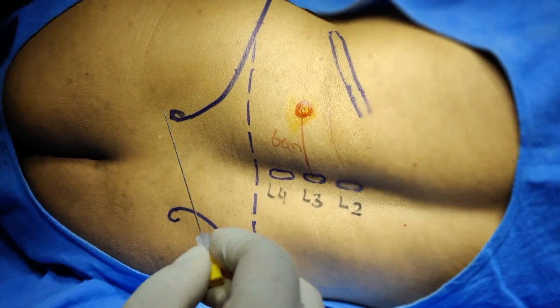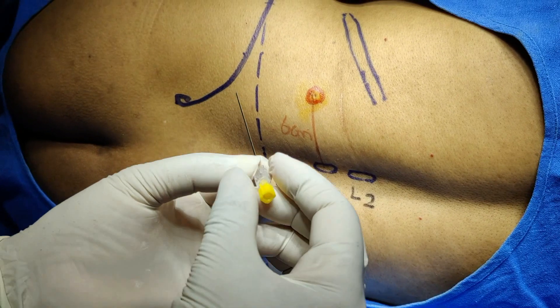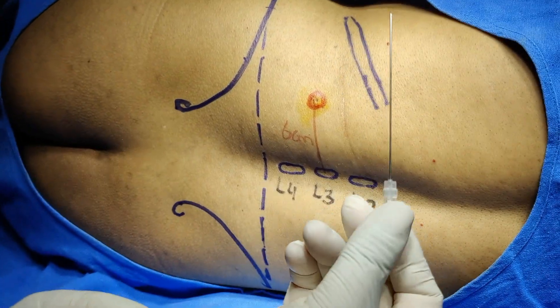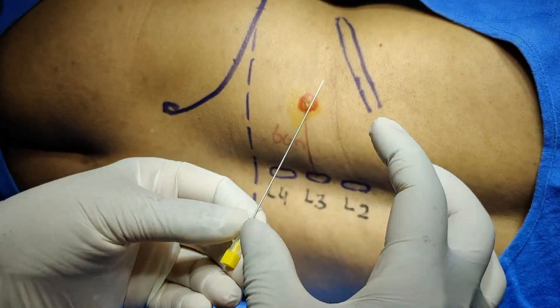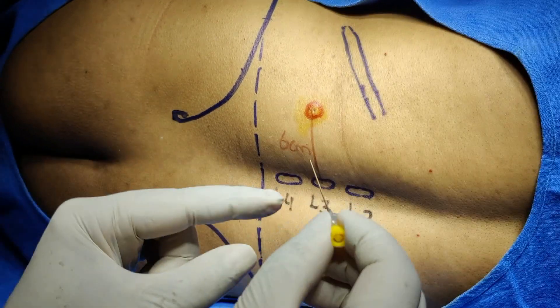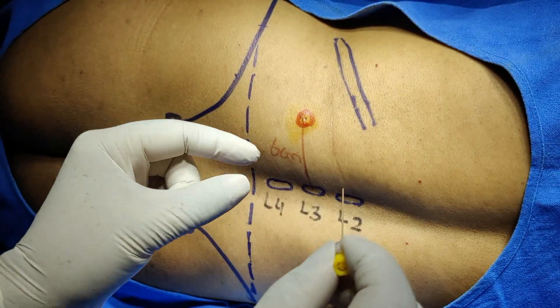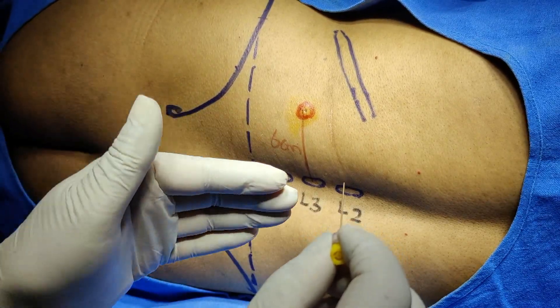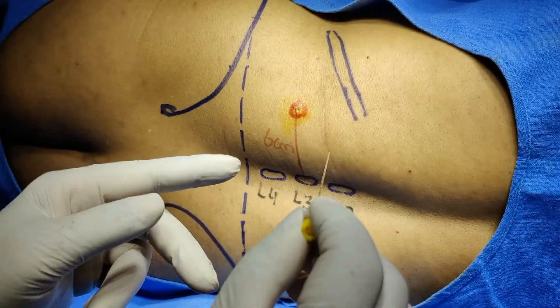Now pass the needle at 30 degrees. I have taken a 20-gauge spinal needle with a length of 9 cm. Insert the needle — if the needle strikes the transverse process at about 2 to 3 cm depth, move the needle either cranially or caudally to bypass the transverse process.